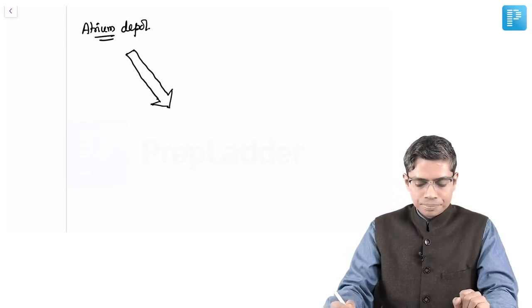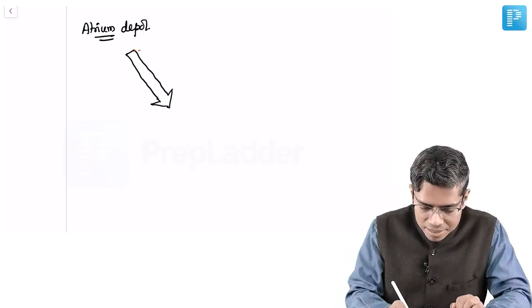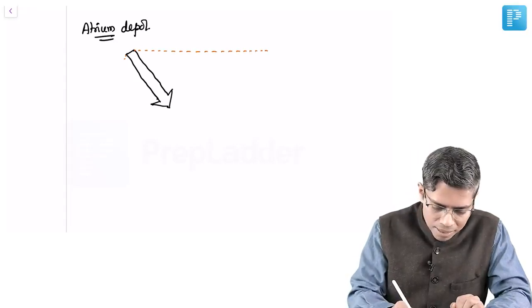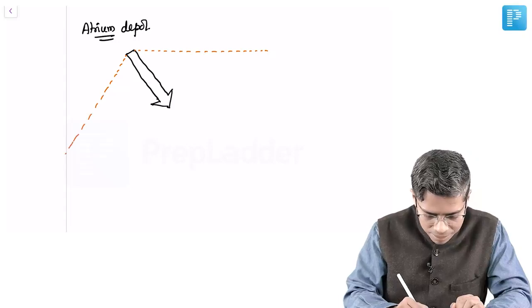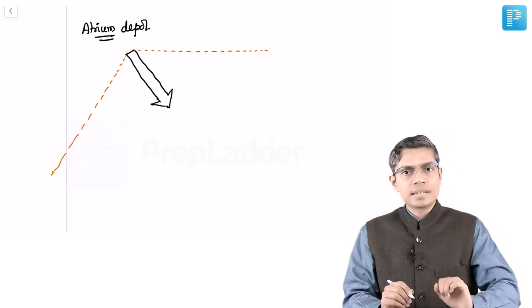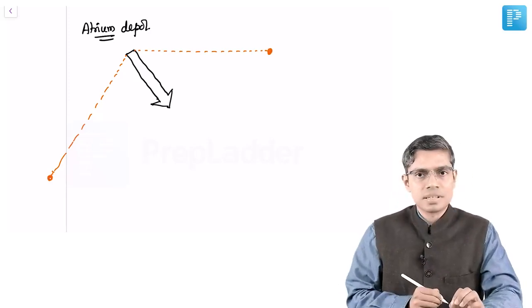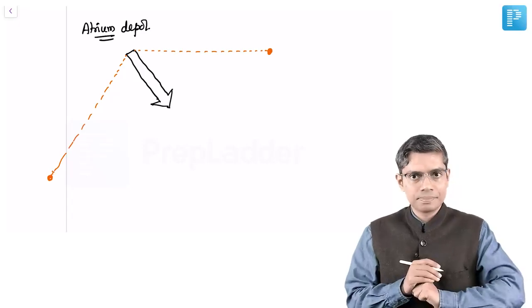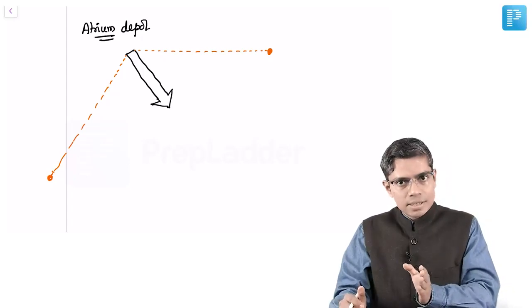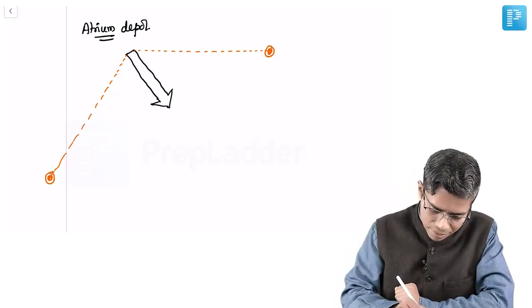Now if I ask you, suppose one lead is connected here, and another lead is connected here, I can understand that the voltage vector is neither directed towards this lead nor towards the other lead, right? So what will happen to the voltage vector amplitude in the direction of these two leads?